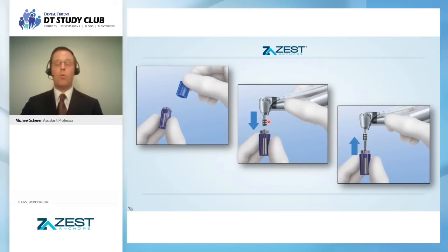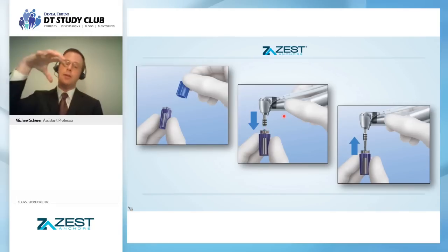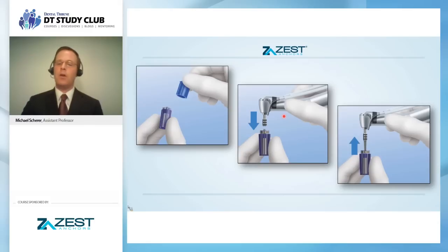The latch driver or the hand driver, depending upon your clinical preference, is going to be snapping onto the implant, as you see here. And now, yes, the first thing that you notice is this is an external hex implant. And what that allows you to do is snap with a little O-ring that's inside of there. So as this surgeon carefully lifts this implant out on this side, we know that it's not going to fall out.